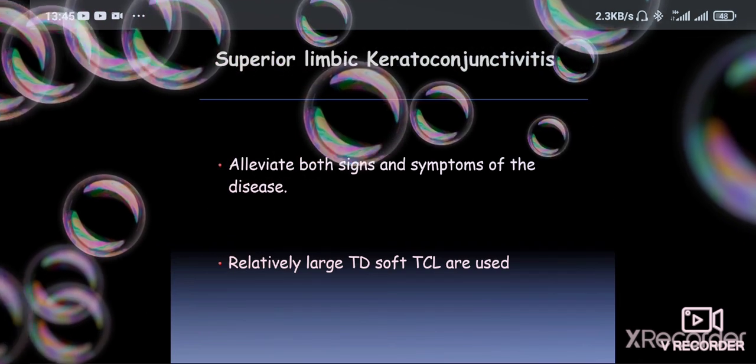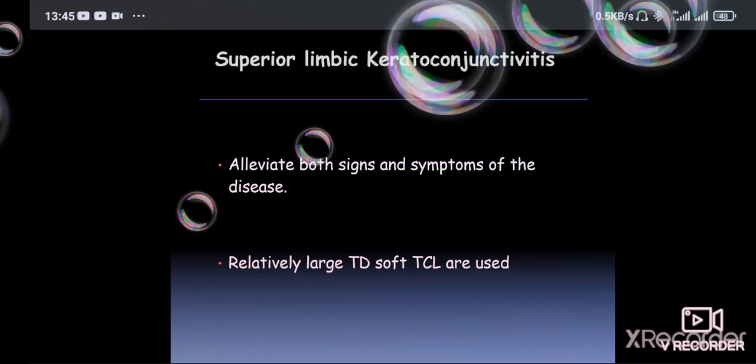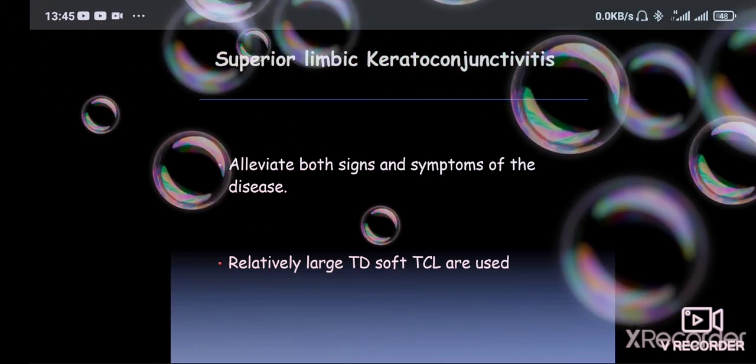Superior limbic keratoconjunctivitis is the other condition. Therapeutic lenses alleviate both signs and symptoms of the disease. Relatively large total diameter soft therapeutic contact lenses are used in this case.